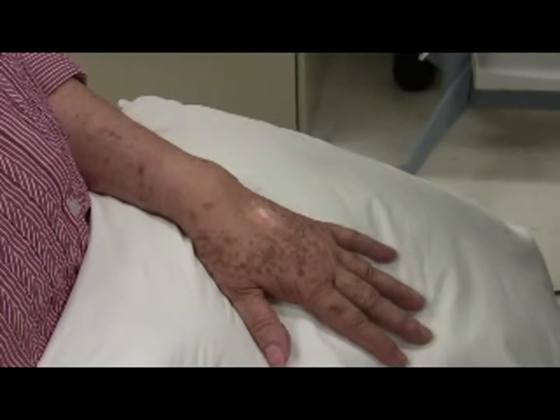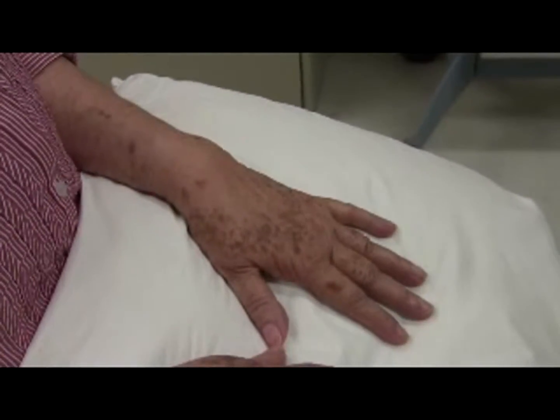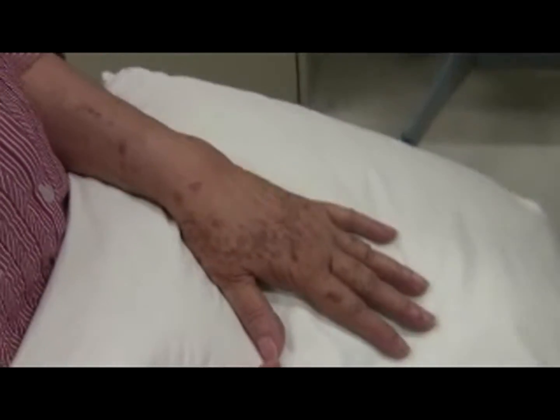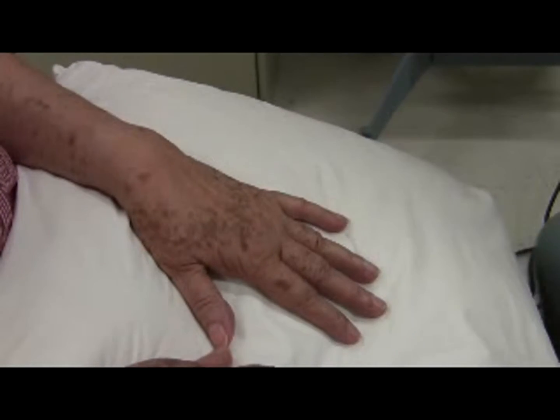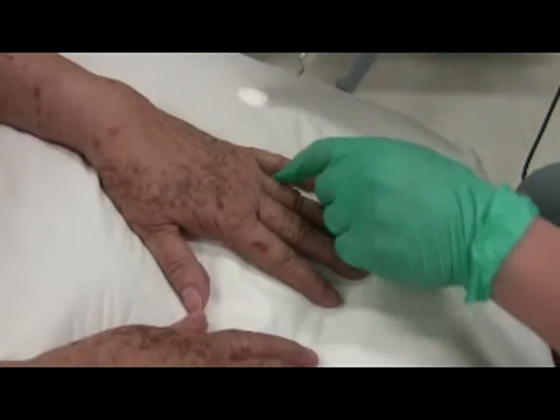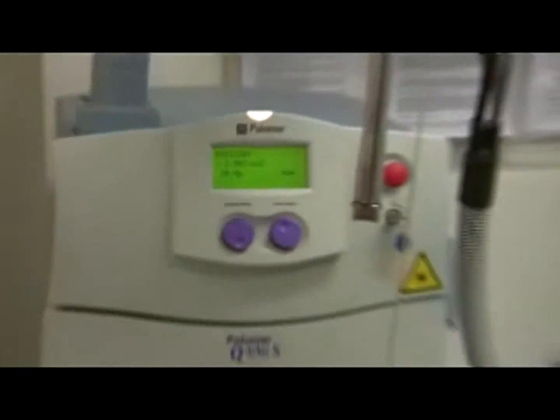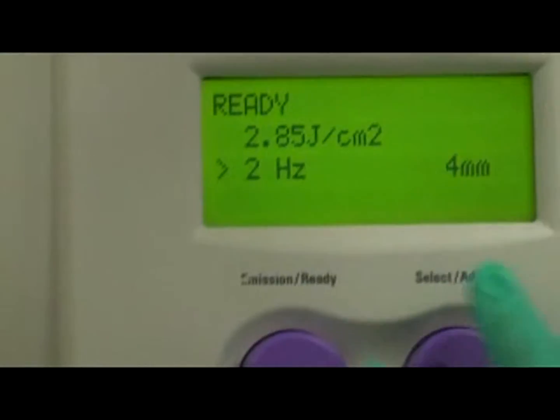Stepping on the foot pedal will discharge the laser. Holding the pedal down will result in pulse emission at the set frequency; releasing the foot pedal stops pulse emission. Experienced users can guide the tip along a target without pulse stacking at high emission rates — it goes pop, pop, pop, pop. You can also press the pedal just once for a single pulse. By setting the hertz to a lower value, the pulses will fire more slowly.